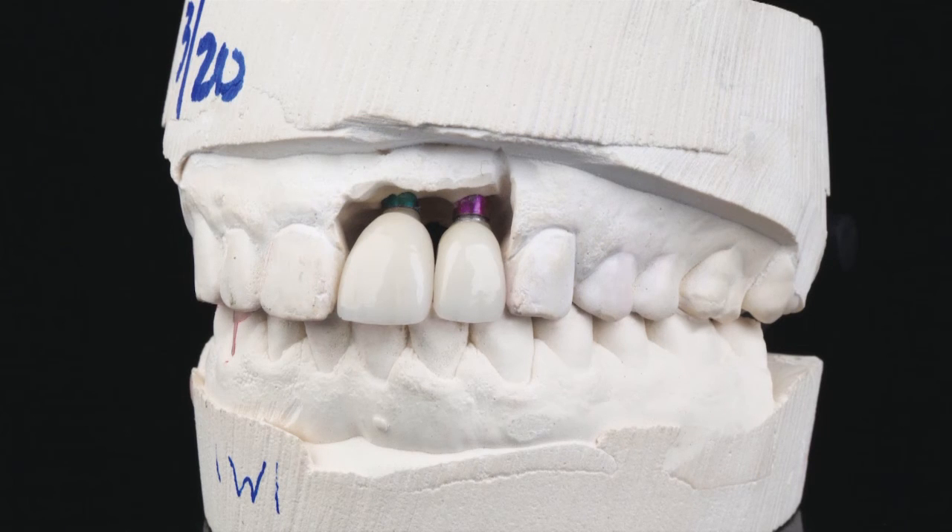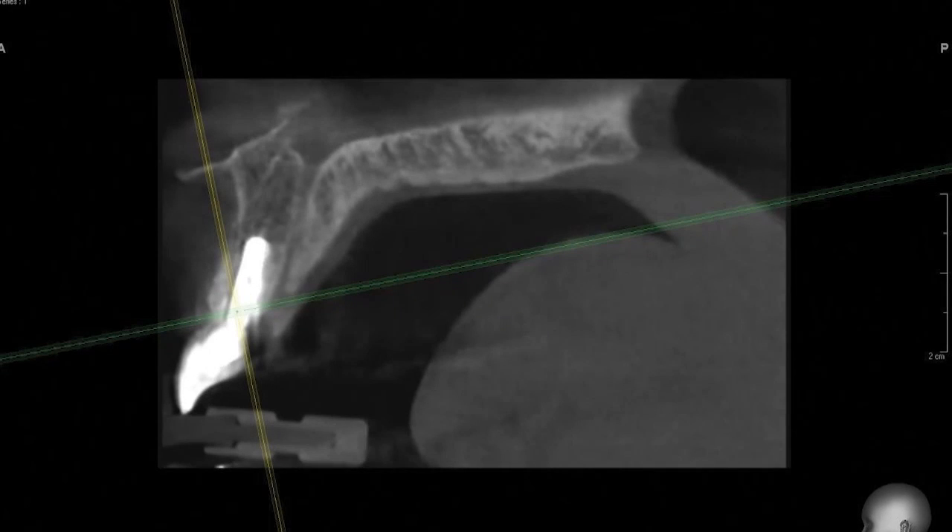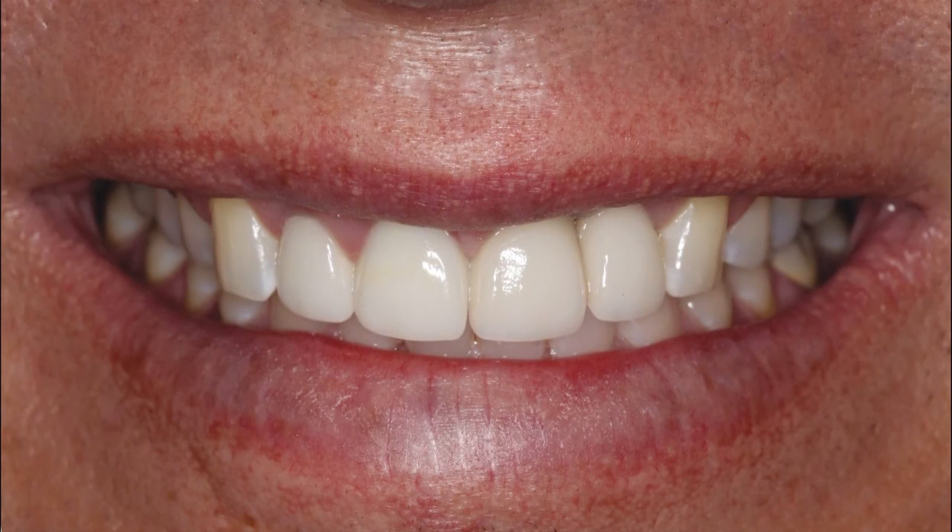The crown, which was digitally designed and milled using CAD-CAM technology, exhibited a precise fit. Final digital radiography illustrated superb bone preservation at the implant site, and CBCT scans showed the sagittal view of the facial bone and the optimal position of the dental implant. The final restorations exhibited translucency, color, and emergence profile similar to natural dentition.